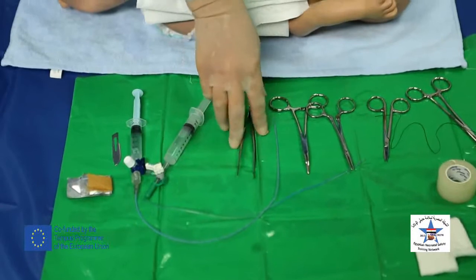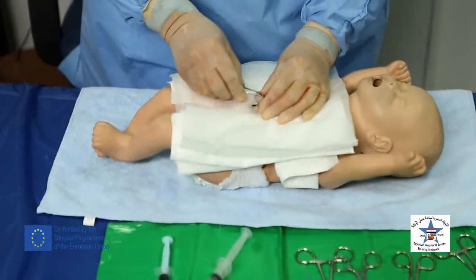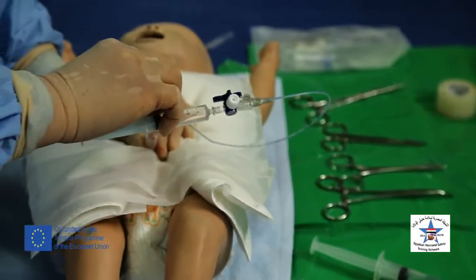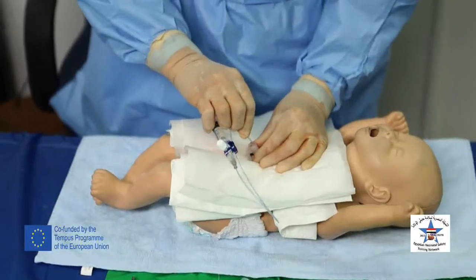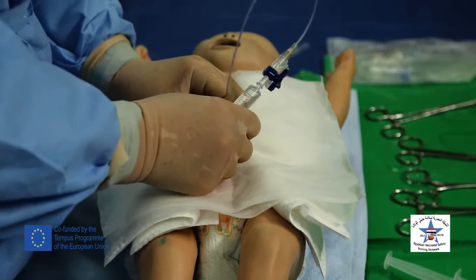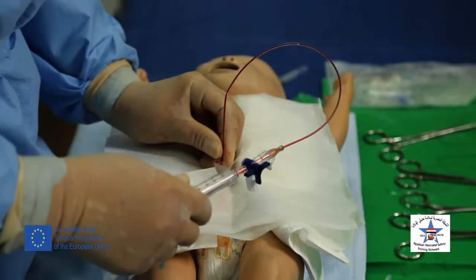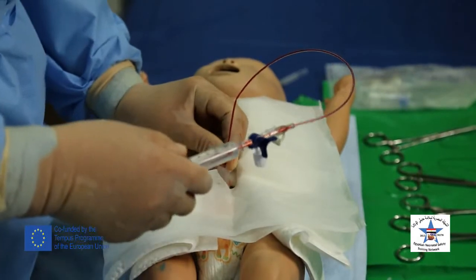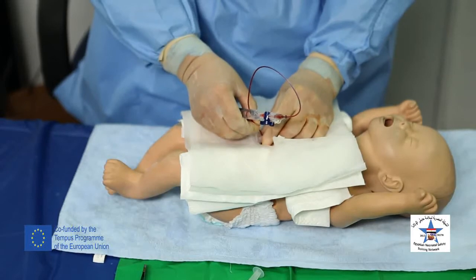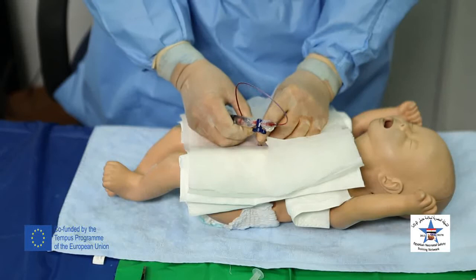Sometimes there is a clot at the tip of the umbilical vein. If so, remove this clot, approach the opening of the umbilical vein and insert the catheter to a distance of 2 centimeters and withdraw blood. If blood is withdrawn in the catheter, then push the catheter inside for the predetermined distance.